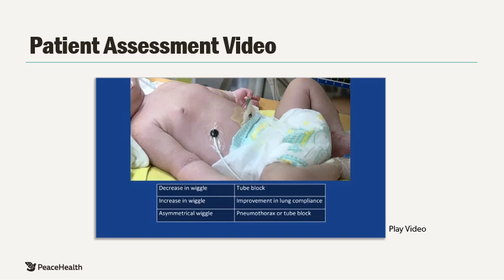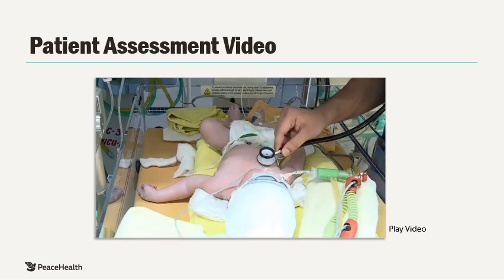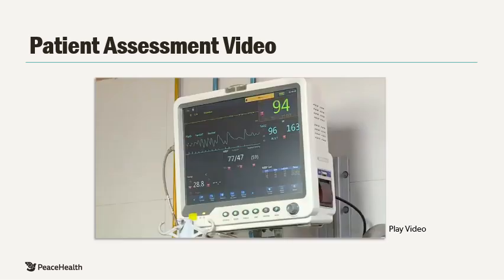We want to auscultate, though normal breath sounds cannot be heard. They are mainly a friction sound. However, you may note changes in the intensity of the piston sound, or it may become reduced on the affected side when the ET tube is too low and is ventilating only one lung, or when a pneumothorax is present.